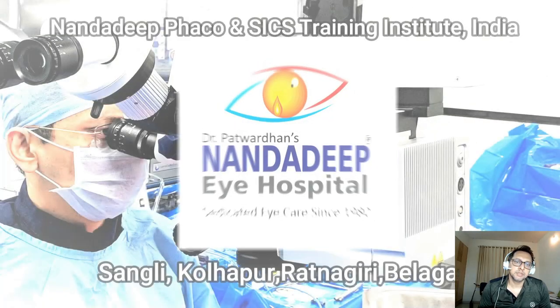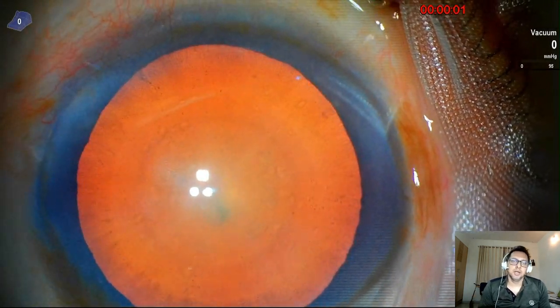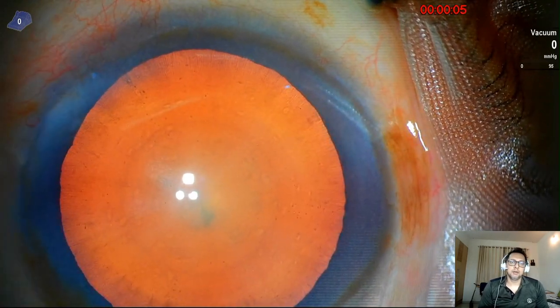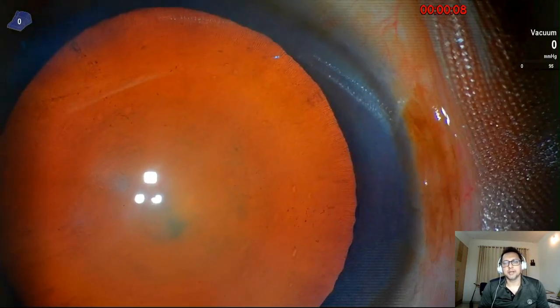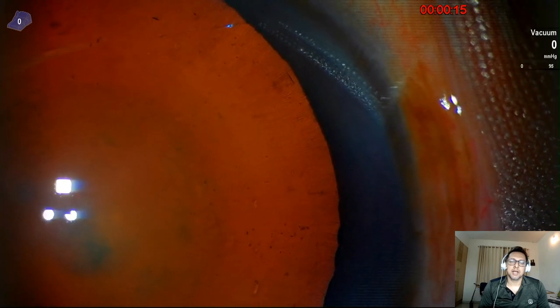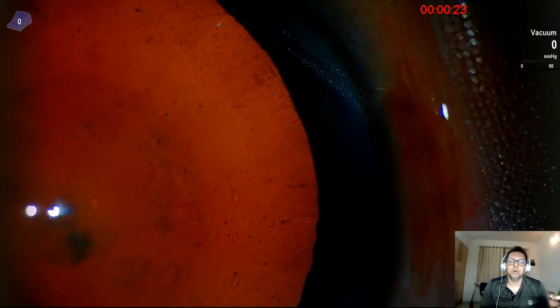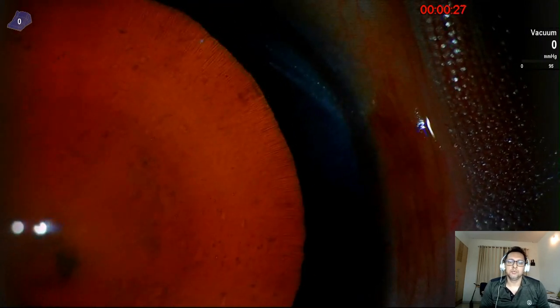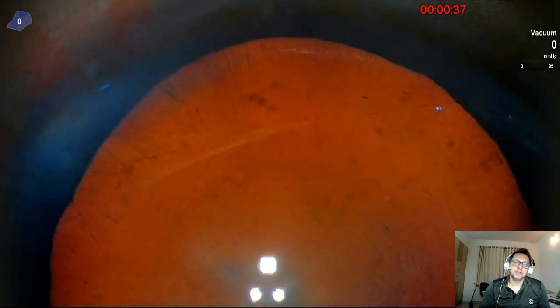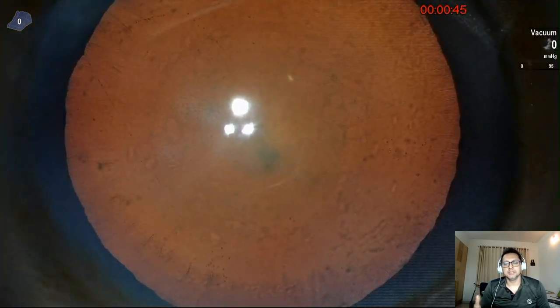I want to show a very simple case, I would say — but of course, no case is simple. There are always a few details of maneuvering involved. Before I begin, I notice a well-dilated pupil here and pause for a moment to see this miraculous structure called zonules. You can see how nicely they're all over 360 degrees holding the lens. If we look at these details, we find miracles happening all around us. Such an amazingly built support system for the lens — and of course, the lens itself is a magnificent structure. We are fortunate to get this opportunity to operate on this diseased lens. We call it cataract.